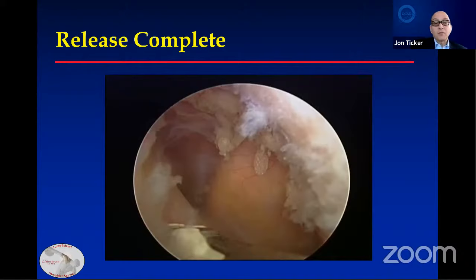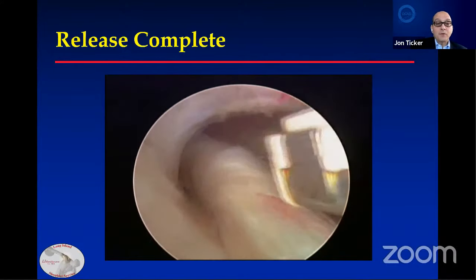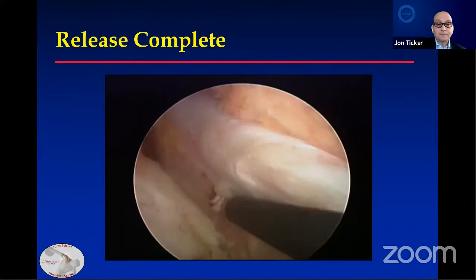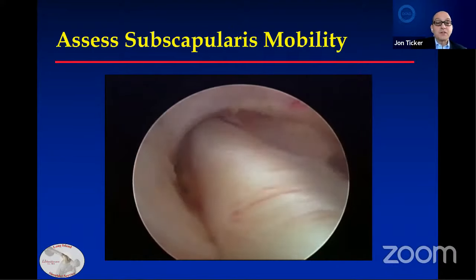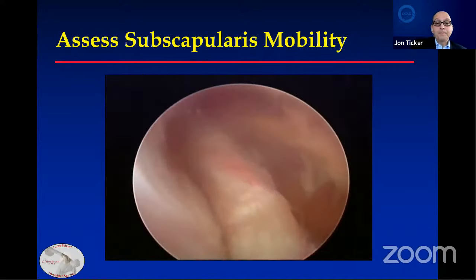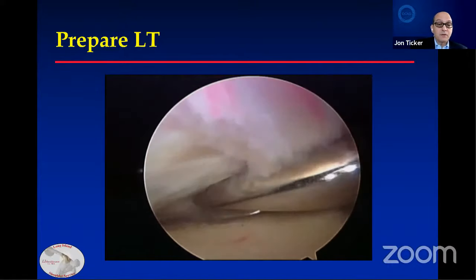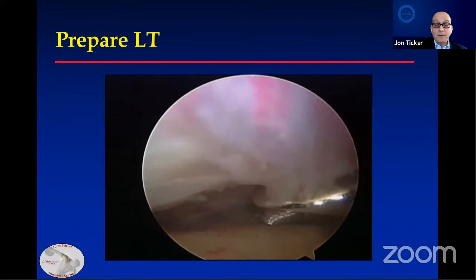This is our same patient with a complete release. If you look into the depth, you can see the vessels beating. You want to check around the subscapularis — anteriorly, superiorly, and posteriorly — for a good release, then check your mobility and pull on the traction suture to make sure the tendon is fully mobile. Viewing from the posterior portal, you have to prepare the bone upon which you're going to lay the subscapularis tendon. You want to denude the soft tissue — I'm just cleaning it up to have a healthy bed for the tendon to lay on and heal to.